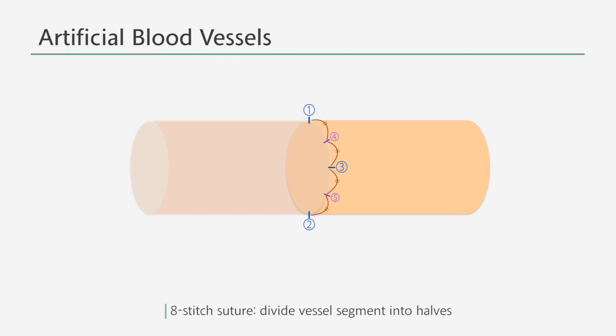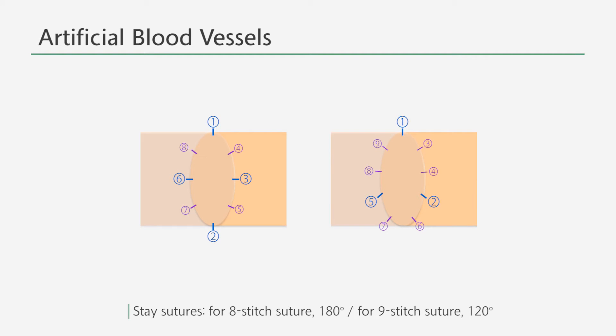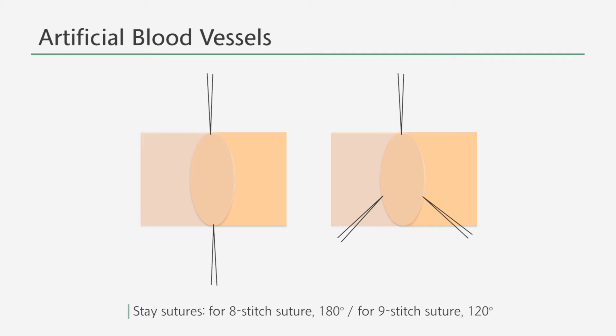For the eight stitch and nine stitch sutures, think of it as if you're dividing the vessel segment into halves and triplets respectively. Generally, the stay sutures are performed at 180 degrees for the eight stitch suture and 120 degrees for the nine stitch suture.